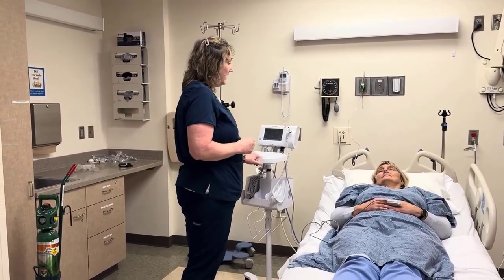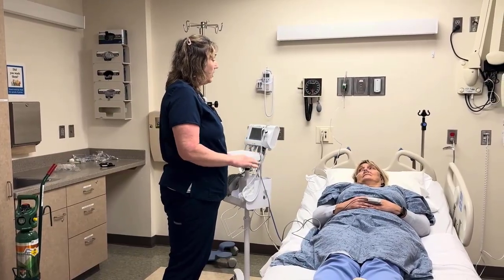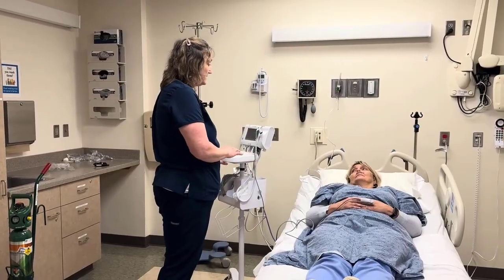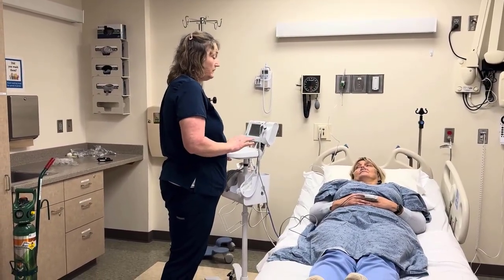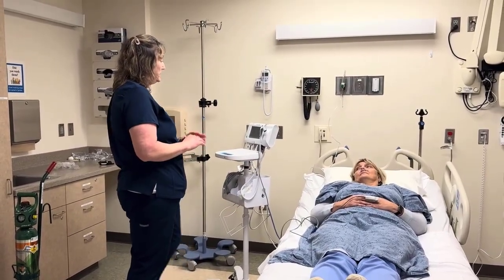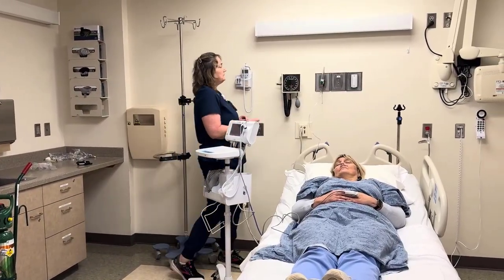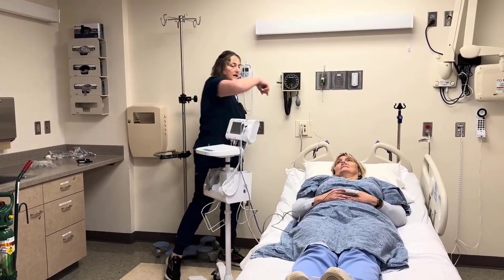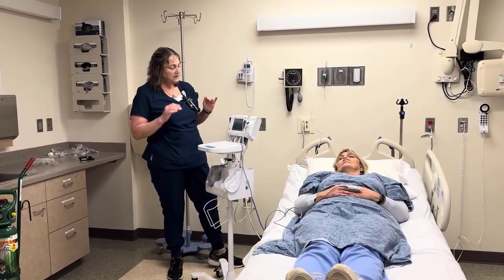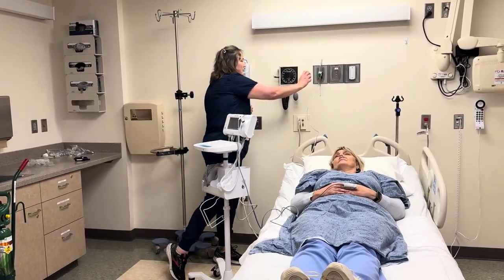And it looks like, Michaela, when you're off of your oxygen, your SATs fall below 88%. You're already down to 87%. I'm not going to let that fall too far, and so 88% is where we wanted to see if you got below, and you are. So I'm going to go ahead and increase your oxygen by 1 liter. We're going to monitor. Doesn't look like it's going above 88% yet. So I'm going to turn it up another liter.